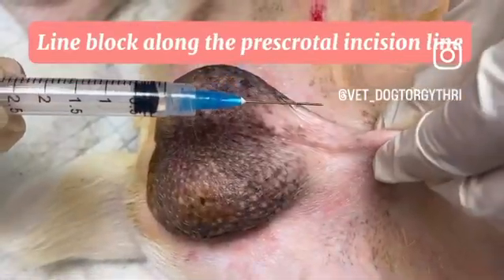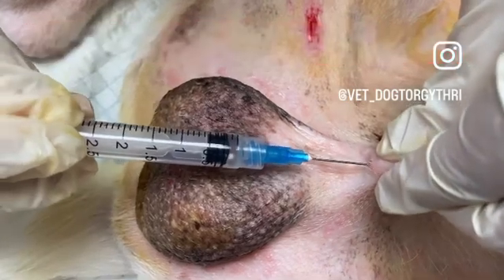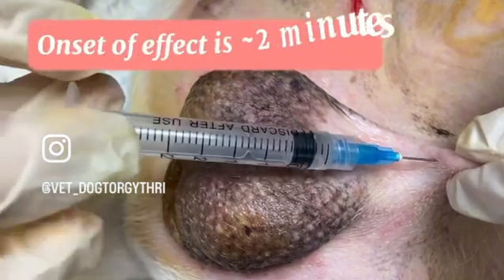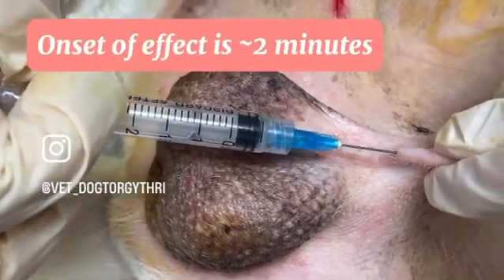Since we're going to be doing a pre-scrotal castration, we're going to do a line block along the pre-scrotal incision site. This local block is done usually before the final alcohol and tincture iodine prep.